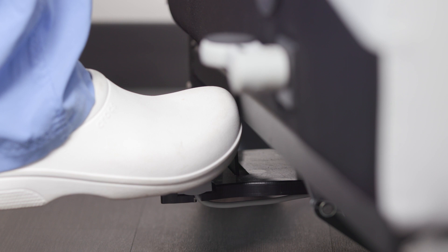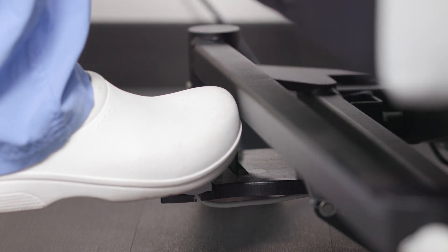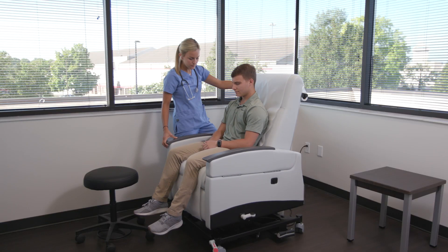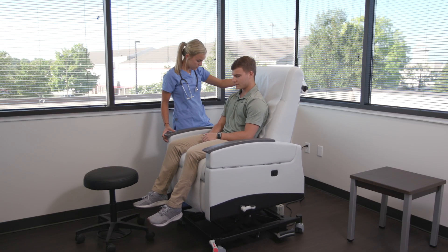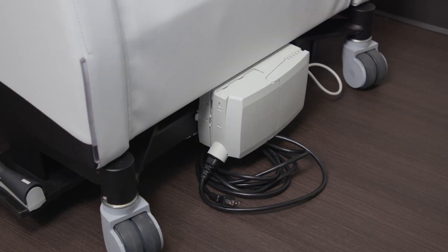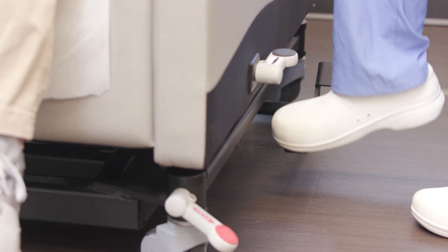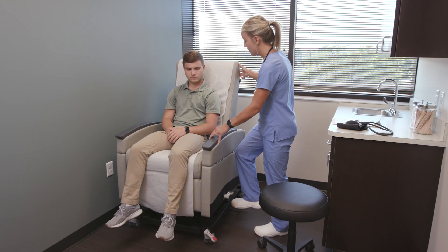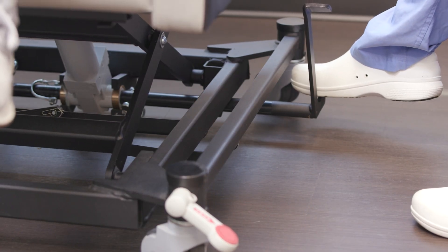This recliner is available with both power and manual hydraulic lifting mechanisms. The power version is activated by an intuitive pedal located on both sides of the chair, which connects to the UL60601 certified motor. A battery backup is available as an extra precaution in case of a power outage. The manual hydraulic version is operated by depressing the pedal on either side of the chair until the desired height is reached. Lowering the height is achieved by simply pressing down on the back of the same pedal.